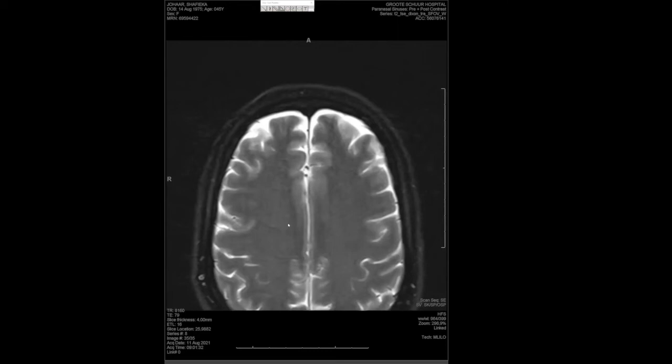So in summary, we have this aggressive posterior nasal or sinonasal tumor with sinus and intraorbital extension, as well as intracranial extension, also with secondary obstructive sinusitis. We've got 3 differential diagnoses. The first would still include the primary sinonasal malignancy. Second is that this location is typical for inverted papilloma, possibly with malignant transformation, although we don't have the typical imaging features of that cerebriform signal intensity. And the last top differential would include granulomatous invasive fungal sinusitis. However, this lacks the homogeneous intense enhancement on post-contrast study.